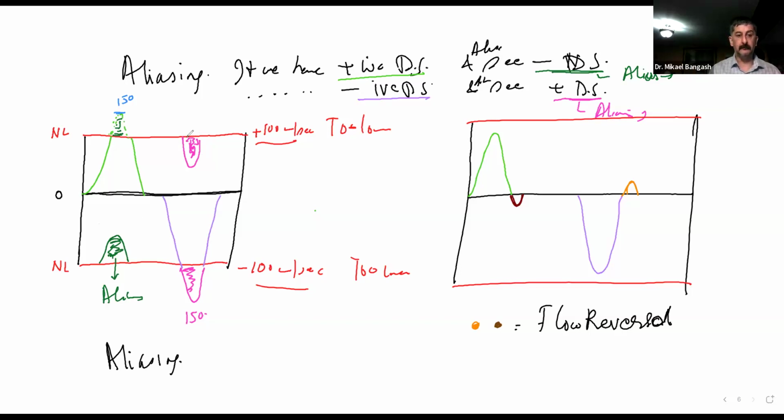Where do you see aliasing? By the maximum velocity of the opposite side, right? Of your spectrum. Clear? Your aliasing was not going to appear here. This was not your aliasing. Your aliasing doesn't appear here. Did that make sense?